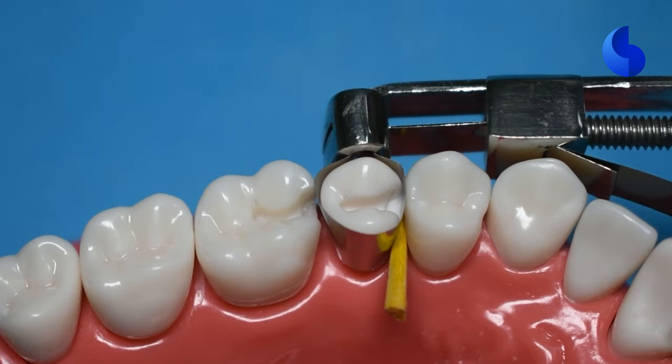In this video, we'll look at a composite restoration on a class 2 MO cavity on tooth number 4. So our first step is to isolate the tooth.